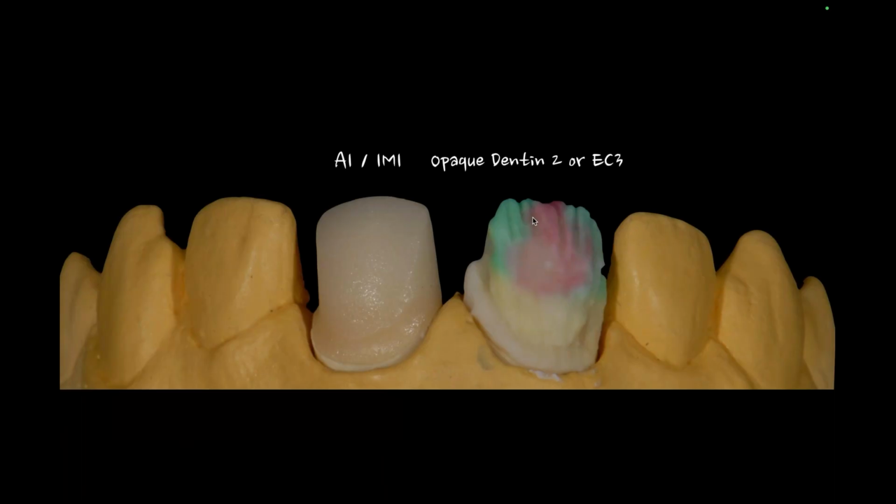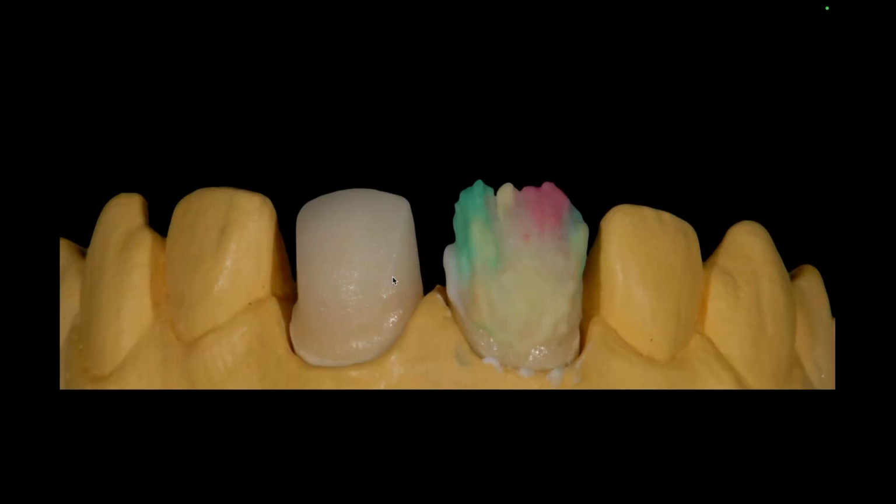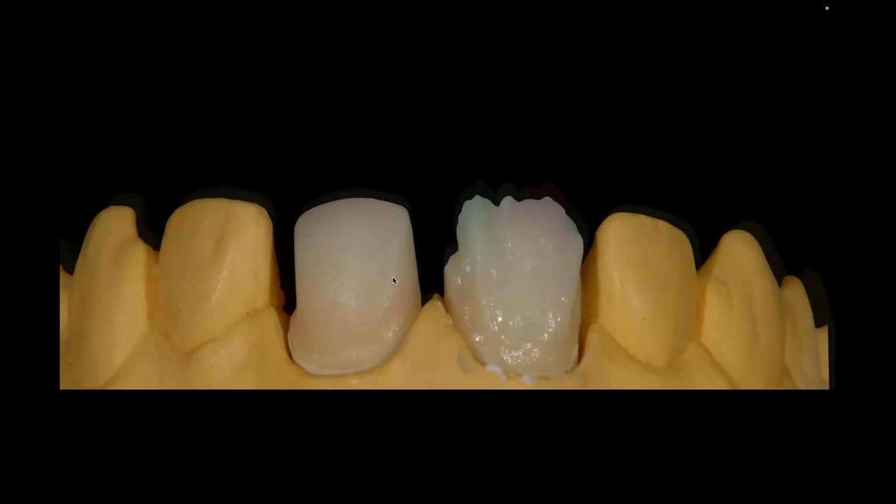I used 4 opacious materials, 1, 2, 3, 4. And on the number 8, I'm using 0 opacious materials. Right, so I'm going to fire that really quickly. So that's just opacious materials on the restoration.